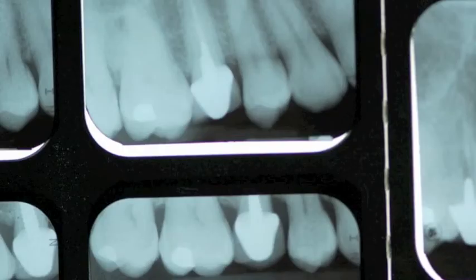This is an x-ray of a new patient who switched to my practice because the porcelain fractured off his new crown. The tooth had a root canal and was filled short with a very short post. I inherited this tooth but didn't want to marry it, so a porcelain repair with SilJet was suggested and accepted.